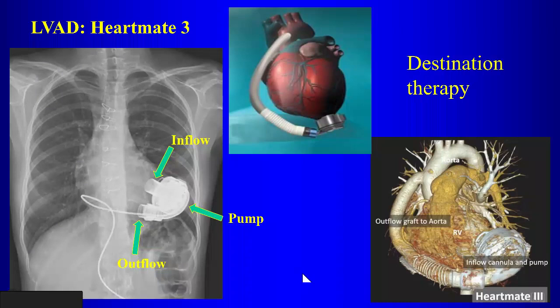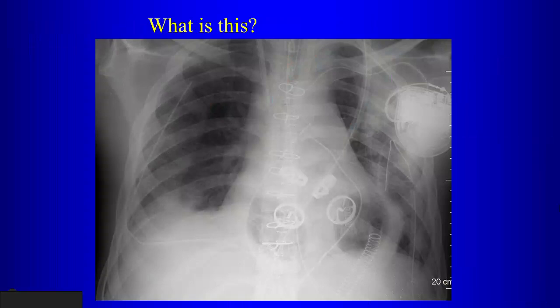Okay. And as I've said, patients who get these are no longer considered candidates for cardiac transplant, which is why we don't see these as often anymore, because they want those patients to remain as candidates for cardiac transplant as long as they can. Okay, but occasionally you might still run into one of these. That's what it is. All right.